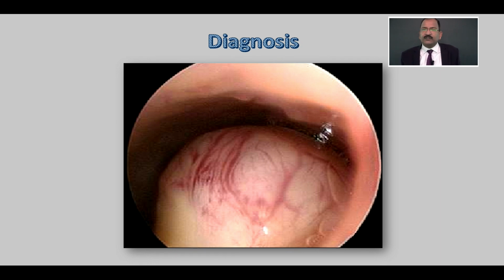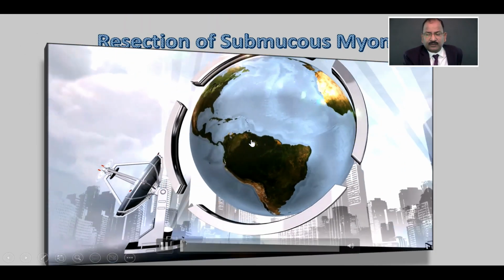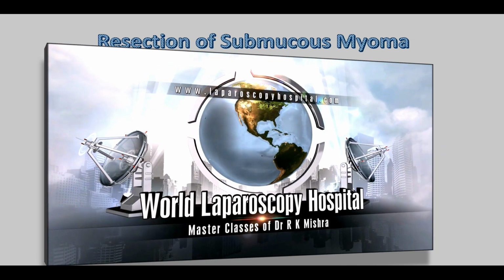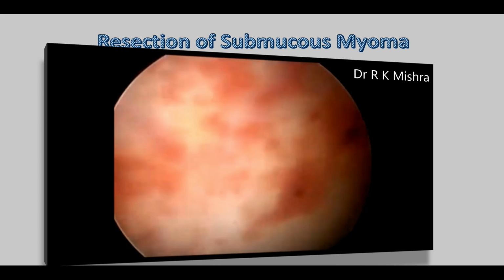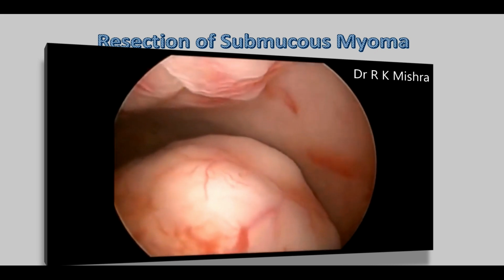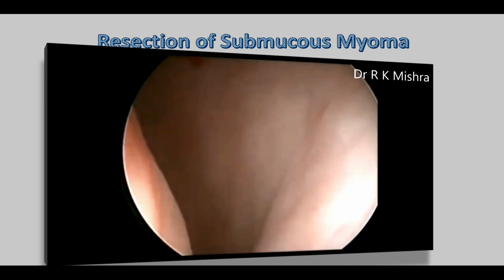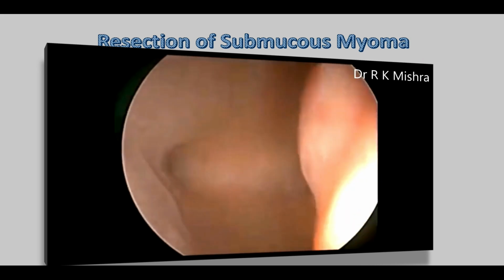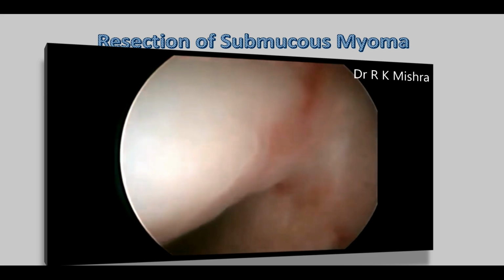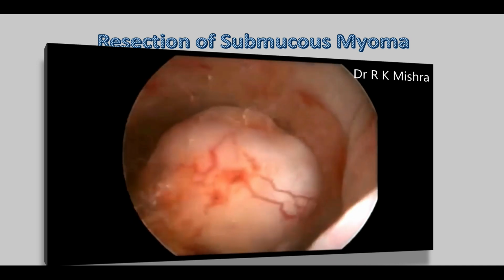Diagnosis, first you will put a diagnostic sheath. After that, you will start dissecting it out. You will use a loop electrode, enter inside, and always you have to come dark to bright, means distal to proximal, and hook, look and cook. Always hook, look and cook. This is the ostia. This is the grade 0 predominantly pedunculated intracavitary myoma. Diagnostic is over. You have seen all around.